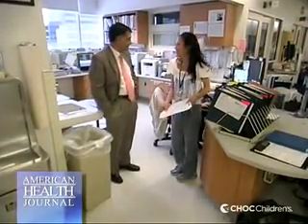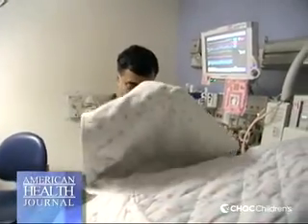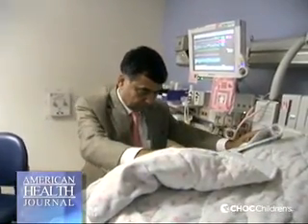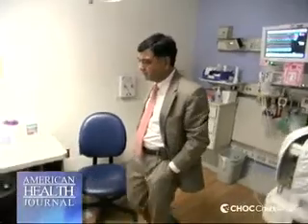We asked Dr. Dhar to explain the cooling cap system. Well, if the baby has been exposed to birth asphyxia, in medical language we call it hypoxic ischemic encephalopathy, and the risk of neurological injury and death is very high, then this promising technology and therapy of brain cooling can be offered. For this to work, it has to be done in the first 6 hours of life. We have to take the baby down to an intensive care environment and start the cooling process.